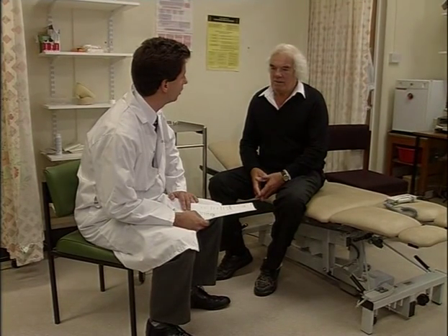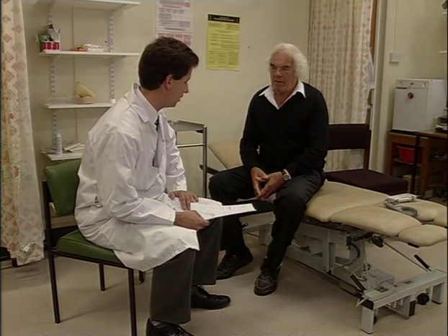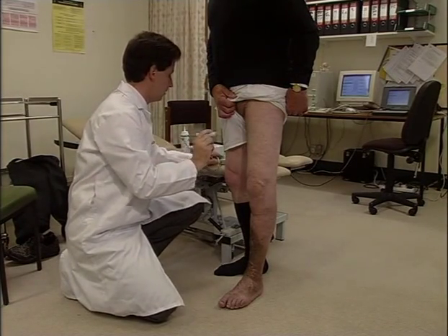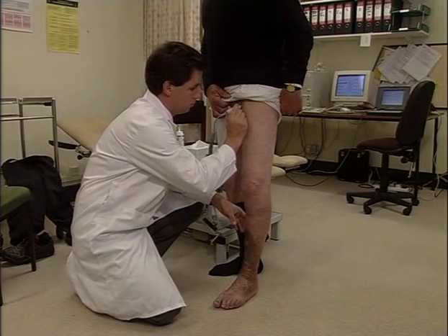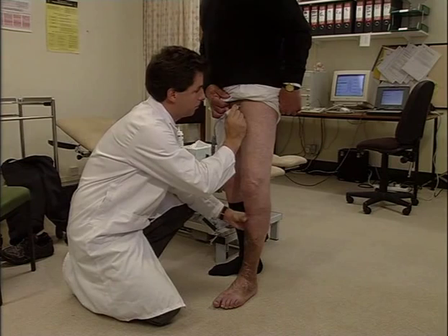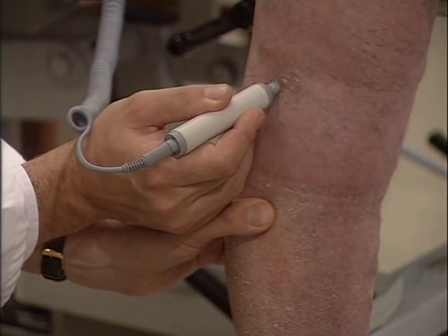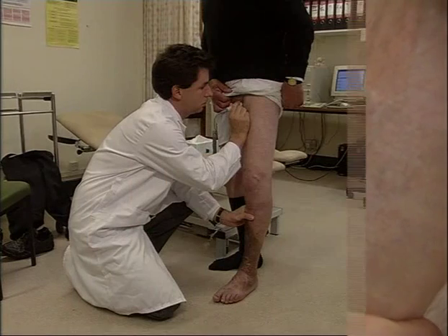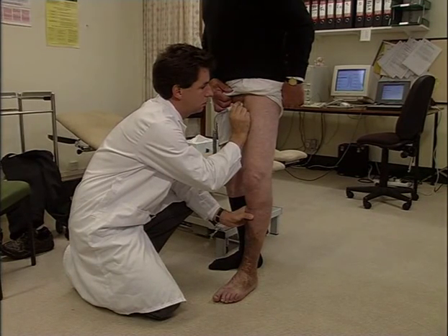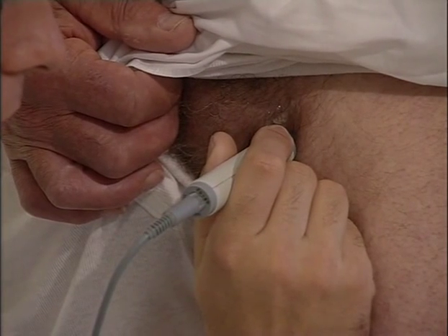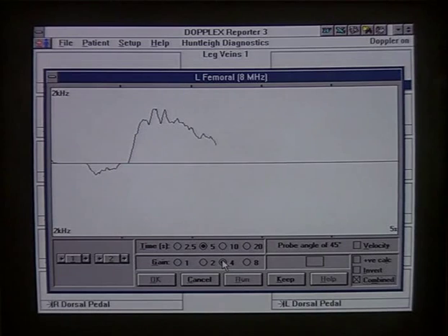Using a combination of Doppler ultrasound and photoplethysmography with a tourniquet, a picture can be built up of valvular incompetence. It's also possible to distinguish between deep and superficial vein involvement. The patient is examined standing up. The Doppler is used to investigate the superficial veins. The main sites typically examined are the saphenofemoral junction, the saphenopopliteal junction at the knee, and sites of suspected perforator incompetence. Pointing the probe towards the heart over the vein, the other hand is used to squeeze the calf muscle to mimic the muscle pump. If the valves are incompetent, then when the pressure over the calf is released, retrograde flow will be detected. In this patient, examining the saphenofemoral junction in the left leg produces considerable reflux, indicating valvular incompetence.